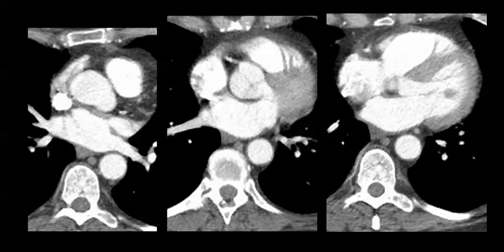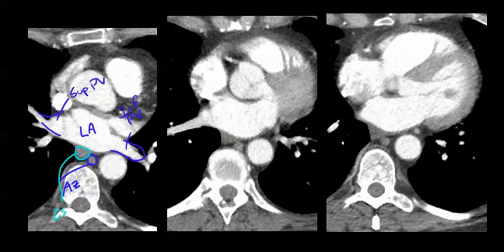The final set of slices is way down at the bottom. Remember this was the subcarinal. Going lower, you start seeing right here your left atrium, and this right here is your inferior pulmonary vein, and here is the superior pulmonary vein. Right back here you have your esophagus, and of course you have your descending aorta right here.